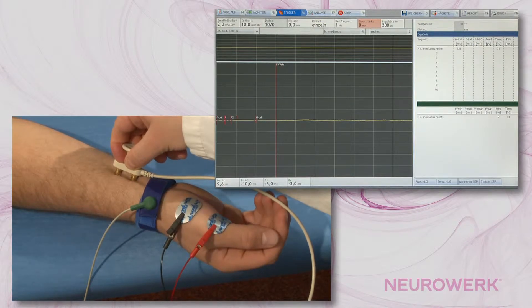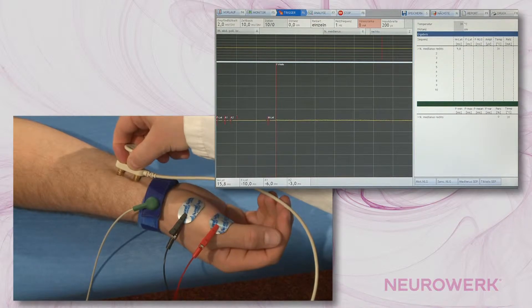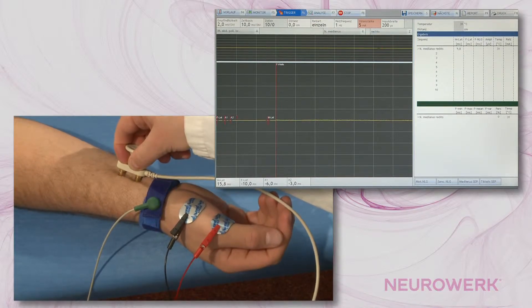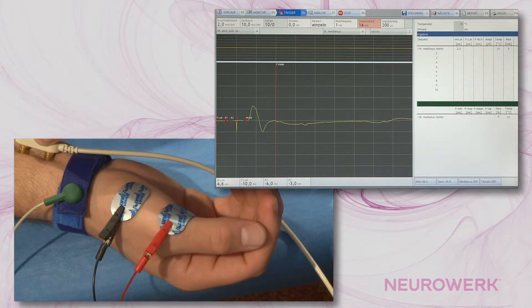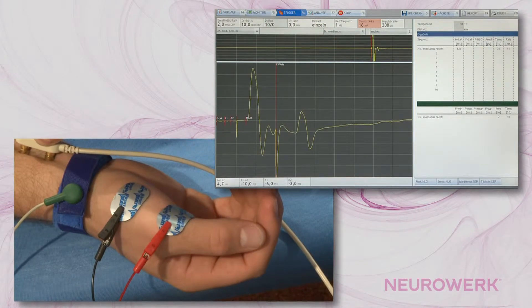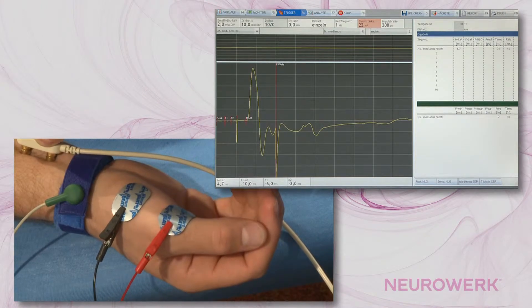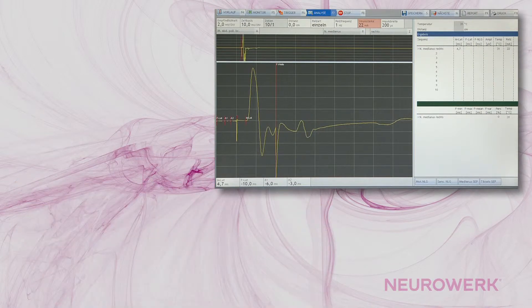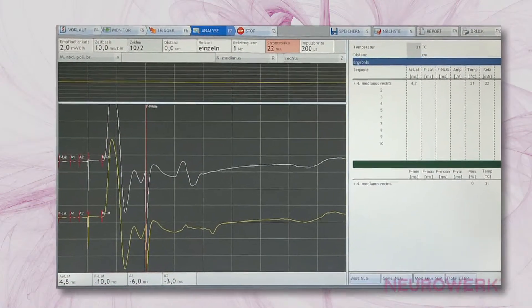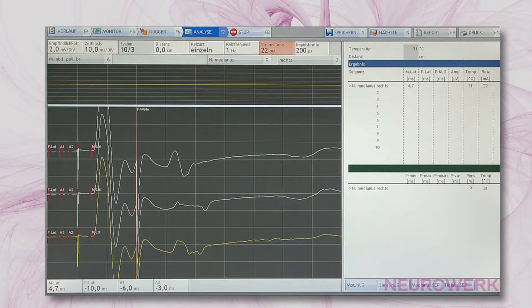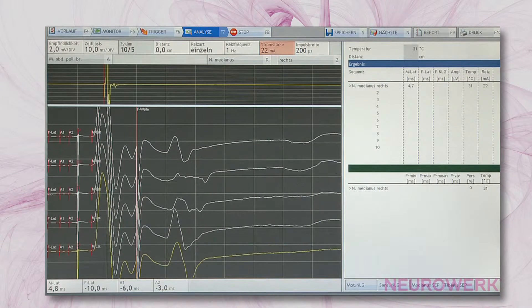The current intensity is gradually increased until the amplitude of the potential does not continue to rise. The current intensity is then increased by another 20% to ensure that all nerve fibers are stimulated. During a constant current intensity, 10 consecutive stimuli are triggered. However, not all have to be responded to with an F-Wave.